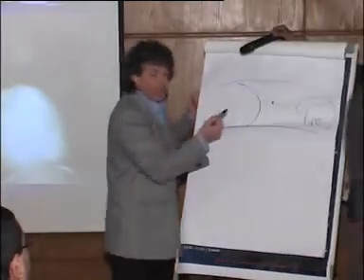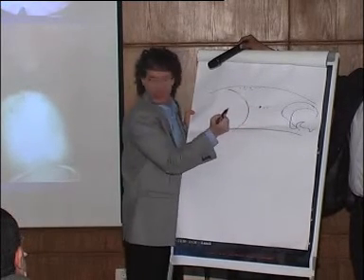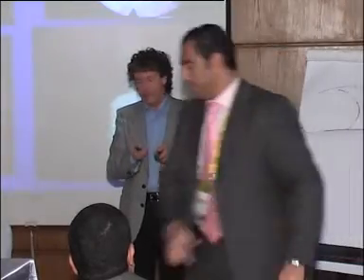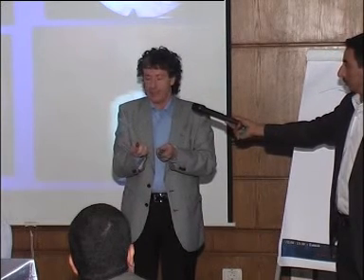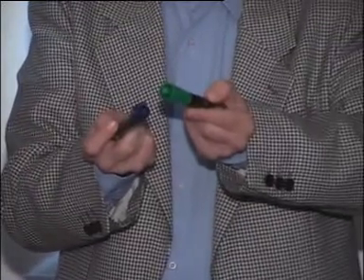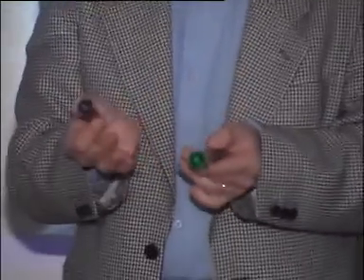The aim is to be very safe and relaxed, just in front of the posterior parietal pleura. And if you need a second point of entry, you choose the same axillary line, one or two intercostal spaces above or under, and you work like this. I will show you tomorrow; there are two ways. If you want to see the tip of your forceps easily, you keep your telescope examining the posterior parietal pleura, and parallel to it you put your forceps until the posterior pleura. Then you can see the tip of your forceps. The second way is to keep your forceps like this, and inside you do like this, and then the tip of your forceps is visible. But the aim of the procedure is to work like this, using two hands.